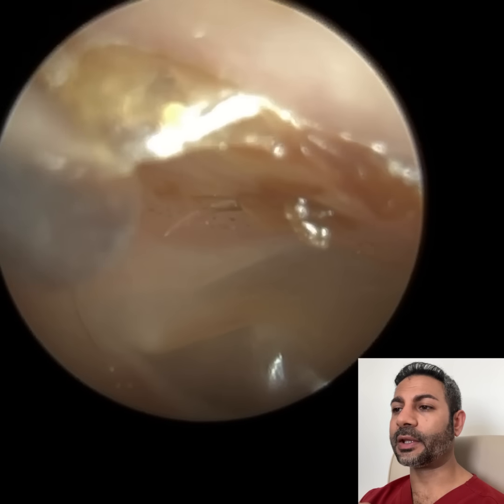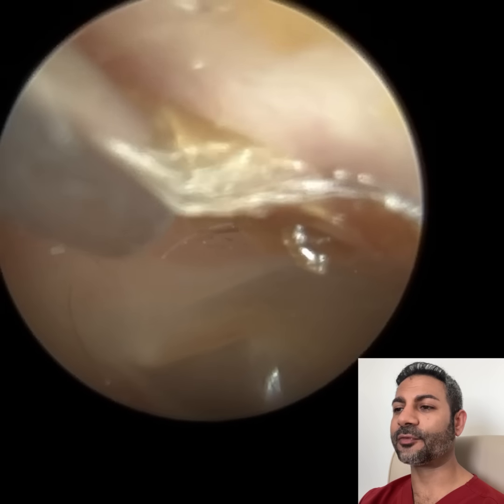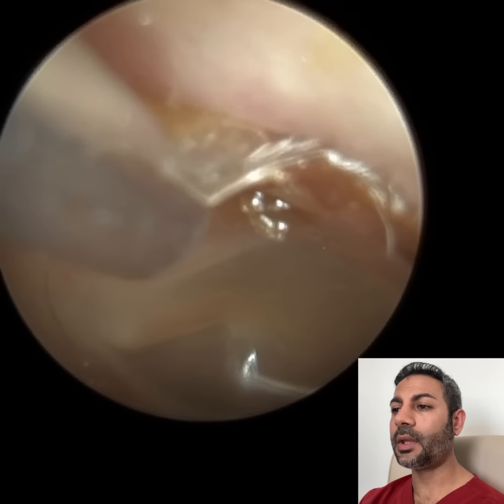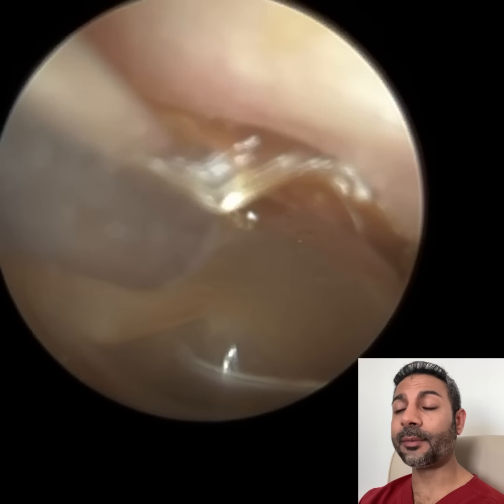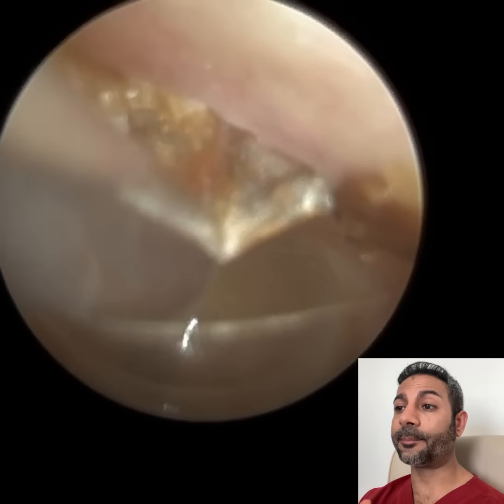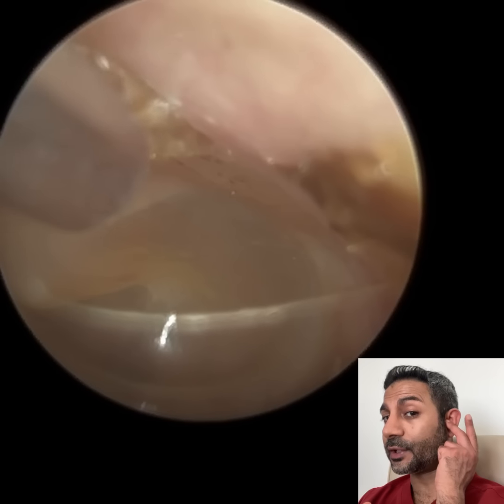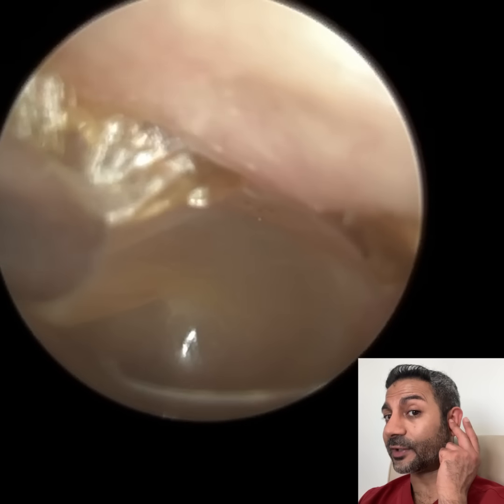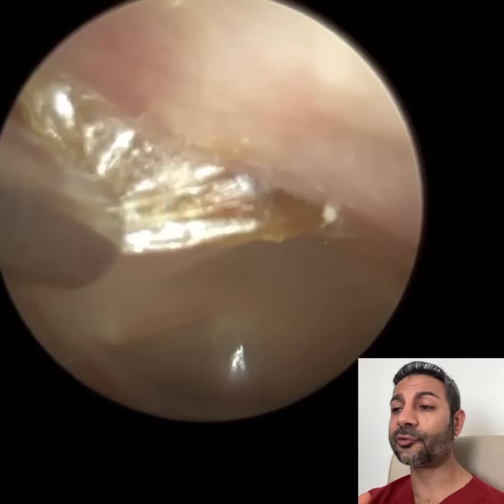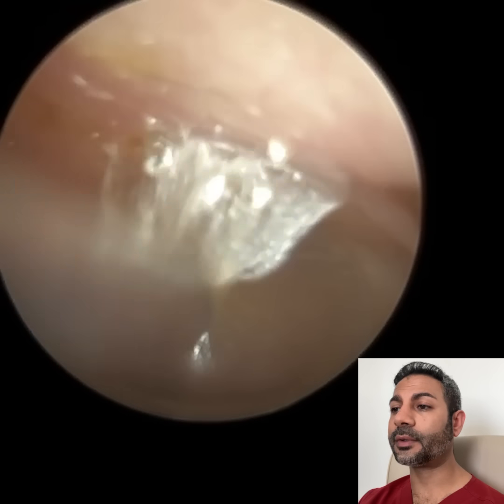Another giveaway, well, we could visually see it in their right side, and we can actually see a few spores here as well, not as much though, is that they exhibited no otalgia, ear pain. A hallmark symptom of a bacterial infection is otalgia, ear pain. One bedside test is to get the tragus and just apply a bit of pressure. If that's painful for the patient, it's a sign of a bacterial infection.